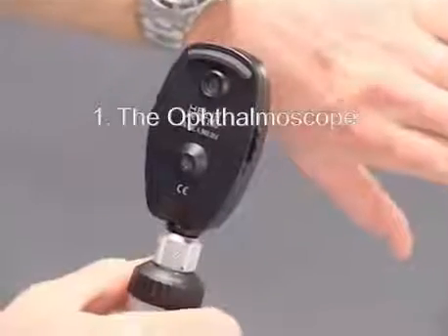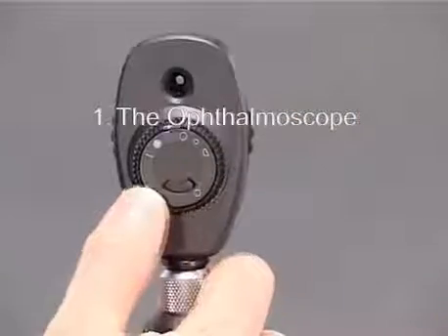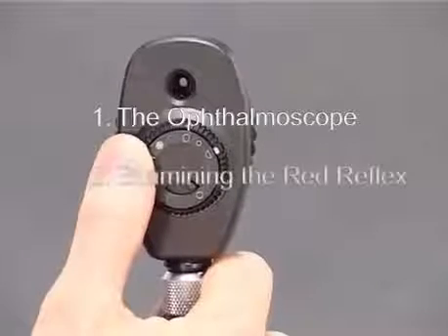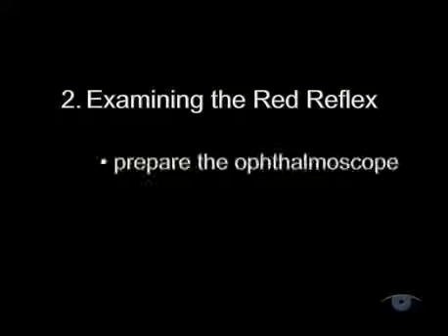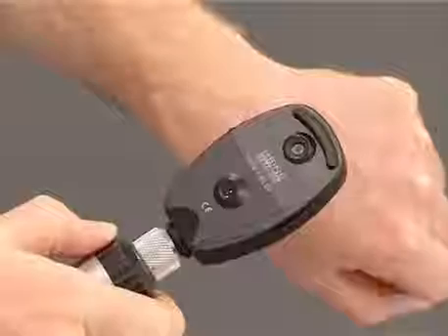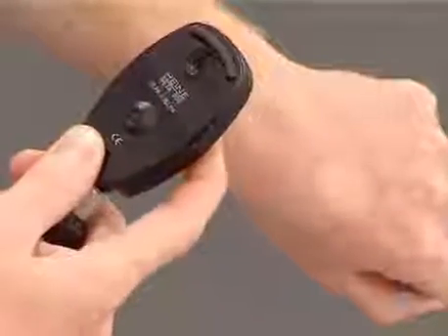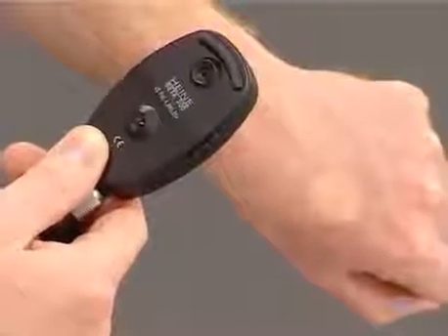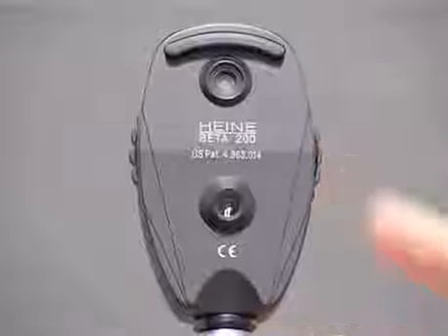You should now have a clear idea of how the instrument works and how to use the three controls. Let's move on to see how to use the ophthalmoscope for examining the red reflex and then the ocular fundus. Think of this in a sequence of three steps: preparation of the ophthalmoscope, followed by preparation of the patient, and finally examination of the eye. To prepare the ophthalmoscope, turn it on, check that it's working, select a large round aperture for illumination, and rotate the focusing wheel so that it's set to zero. The instrument is now ready to use.